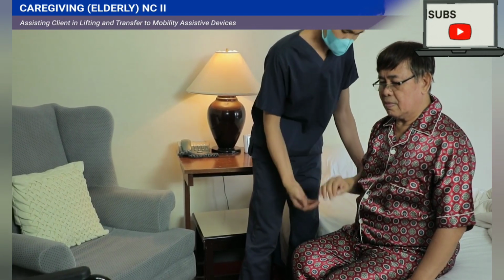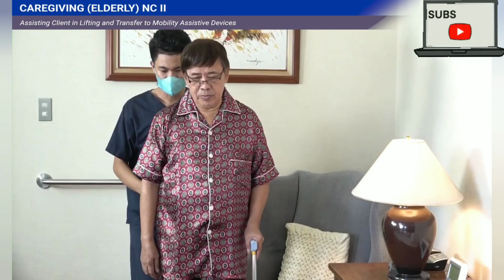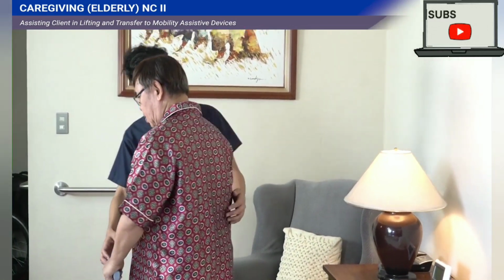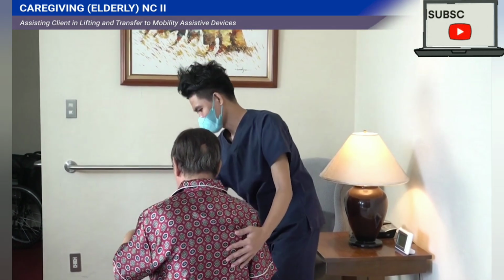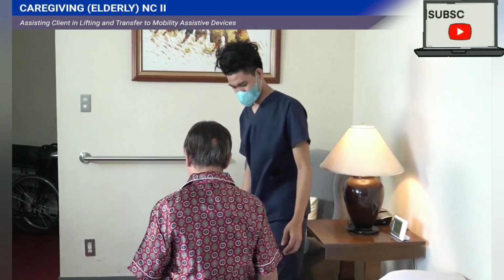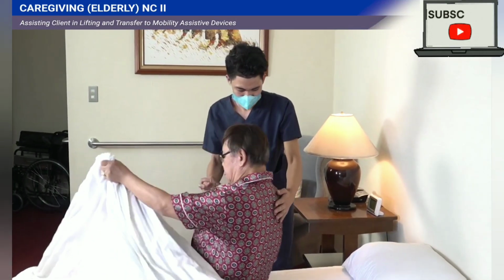To assist the client in transferring from a cane or walker to the bed, first, allow the client to move as near to the bed as possible. If the client needs further assistance in getting to the bed, place your hands around the client's upper back. If the client has a weak arm, place your arms around it and not under it. Use a transfer belt if you're physically unable to move the client.